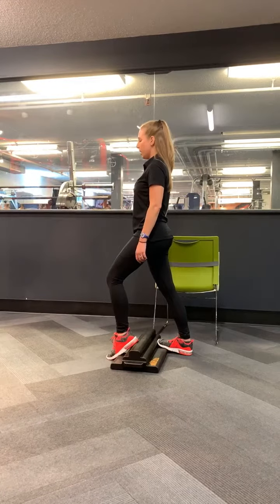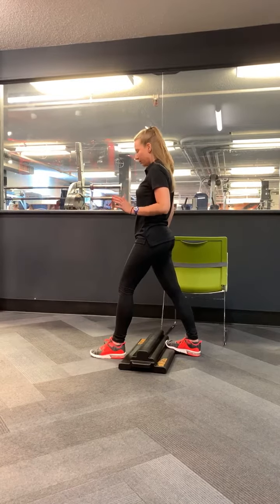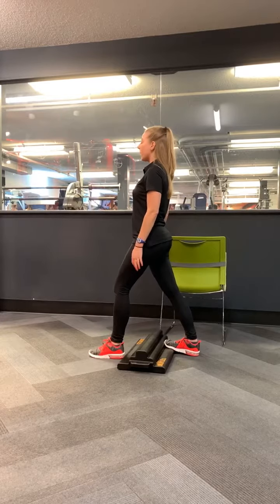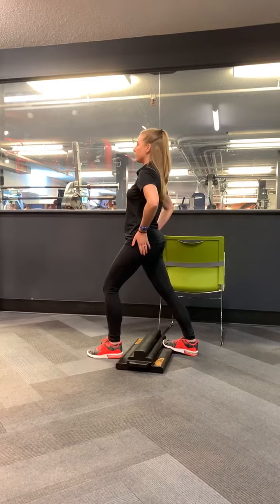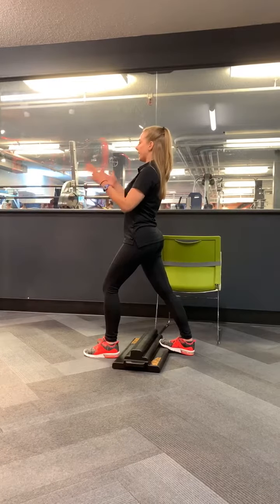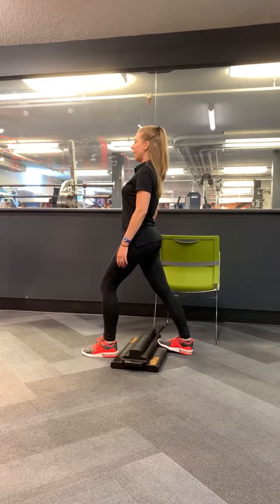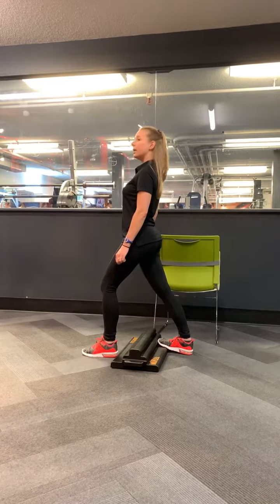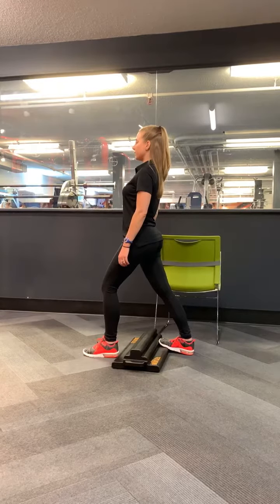We're going to go into pre-swing phase, which is the 4th phase. You're going to bring this left foot all the way in front of the Moflex, striking that heel first on the ground so that our entire foot is in contact with the ground. Again, you can bend that front knee so you can bring those hips forward, keeping your shoulders nice and tall. Make sure you have a nice straight, neutral alignment. Keep your head tall, stand tall, and we're going to hold this 5 more seconds.